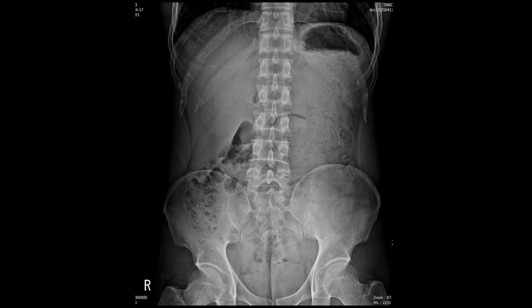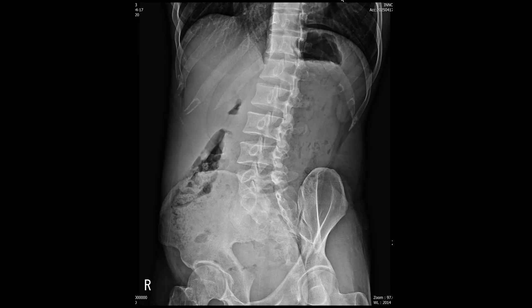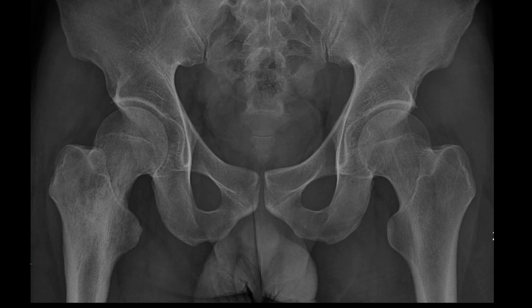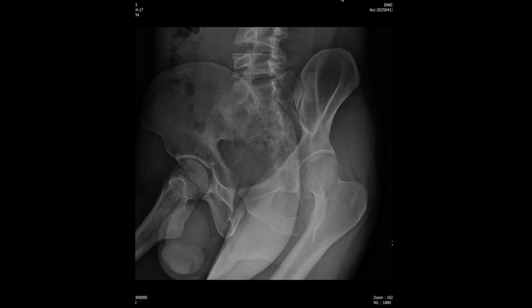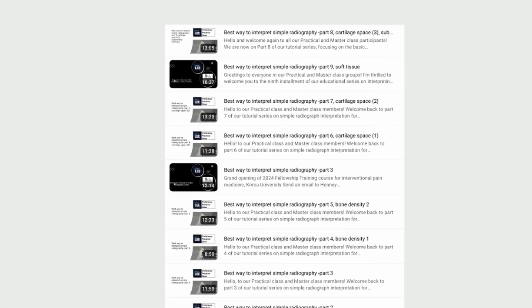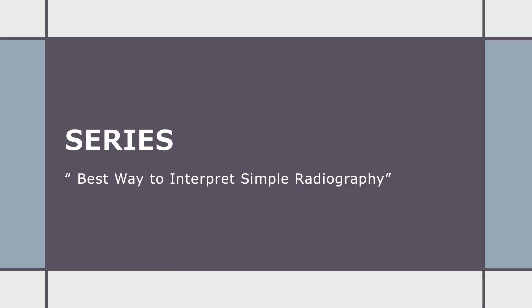On plain X-ray, I noted ill-defined sclerosis involving the femoral neck, intertrochanteric region, and greater trochanter, primarily affecting the medullary cavity. If you cannot recognize the radiographic changes in the right femur, I recommend reviewing the tutorial on interpreting plain radiographs — you can tap on 'Best Way to Interpret Simple Radiography' and go through it again for a clearer understanding.